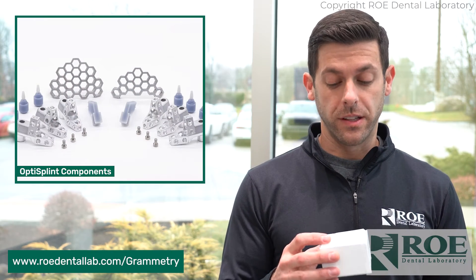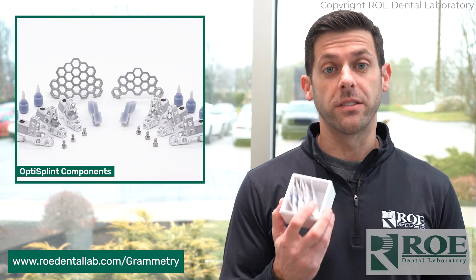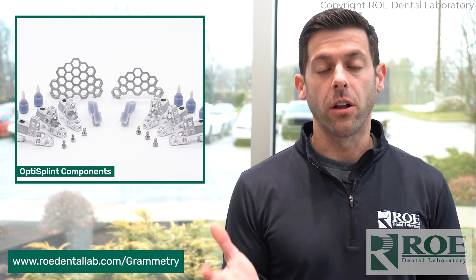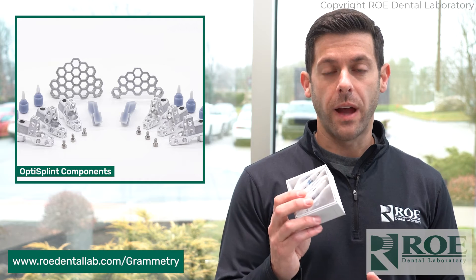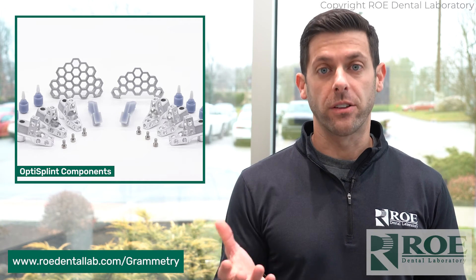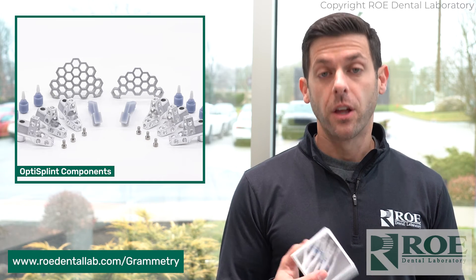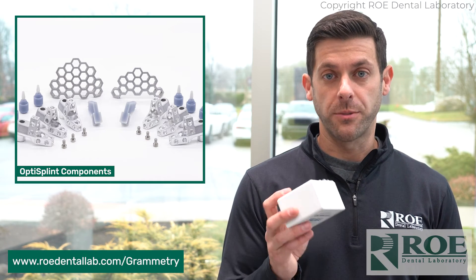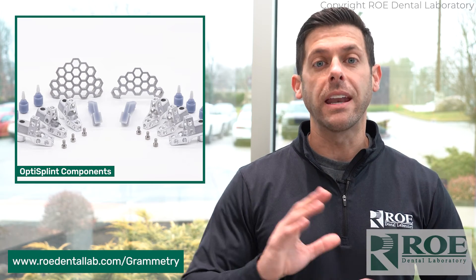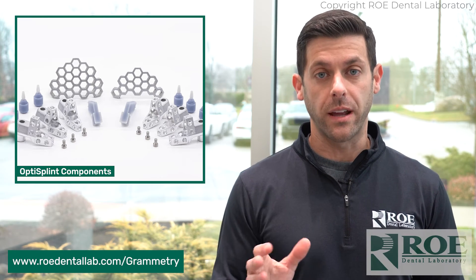Once you have this, this is enough for one patient. There are six scan bodies in here. If you need additional, we can get those a la carte to you. Once you have these looped together, you send those to us and we're going to make a model for their final zirconia. They are patient-specific, so you will purchase one of these for each patient — but it's such a low cost. It's a great solution. Anybody can do it with your intraoral scanner.